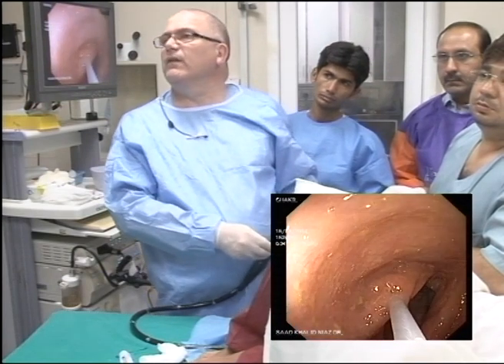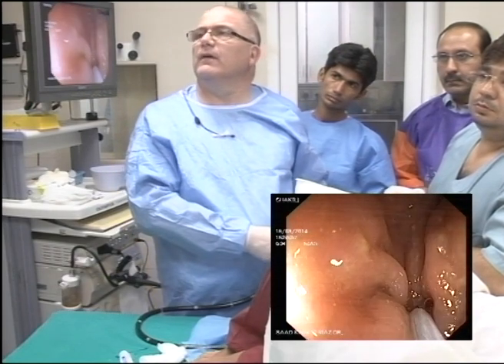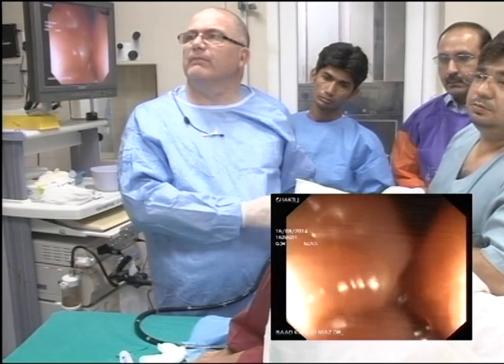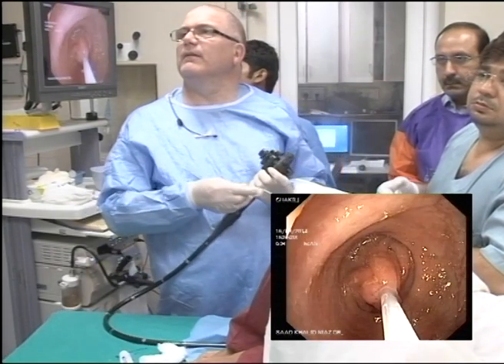Slowly open, boss. Slowly. That's enough. Now pause. Now close again. Paul, what are you doing? There's a tiny little polyp. Oh, you're taking that tiny little thing out, which we saw.